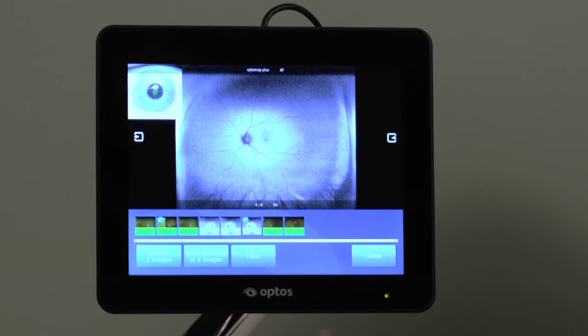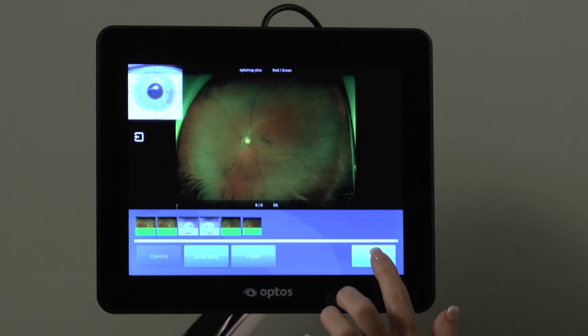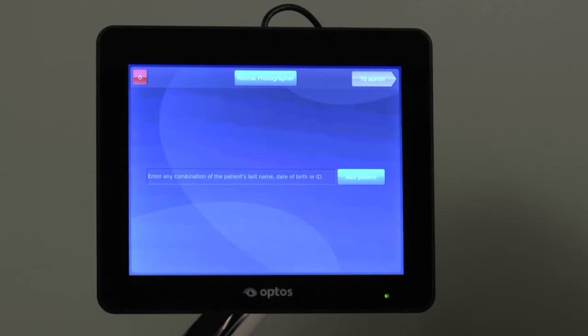You may delete the selected images from the series by pressing the delete button and confirming with Delete Now. If the imaging session is complete, select the close button to exit the image review screen. Then tap the Finished Patient tab and the images will be pushed to the server where they will be available for review.